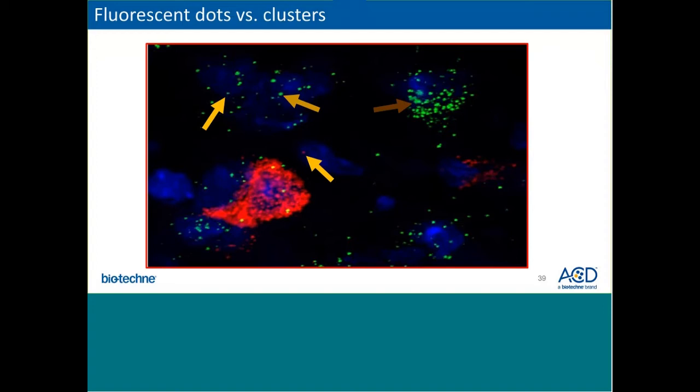Similar patterns of dots and clusters are seen in fluorescent versions of the assays, so that the orange arrows point to single mRNA molecules with fewer ZZ probe pairs bound to them compared with the dots pointed to by the brown arrow.